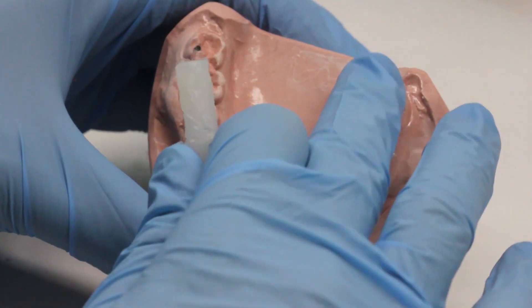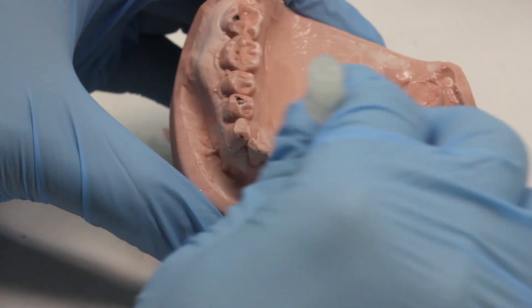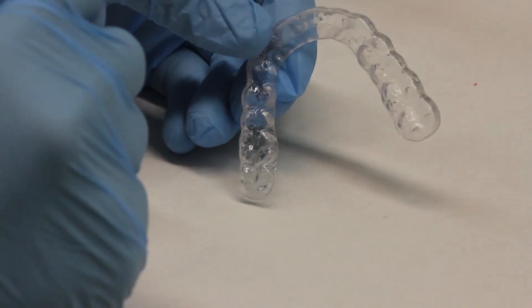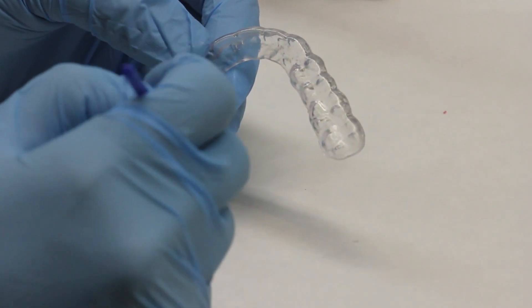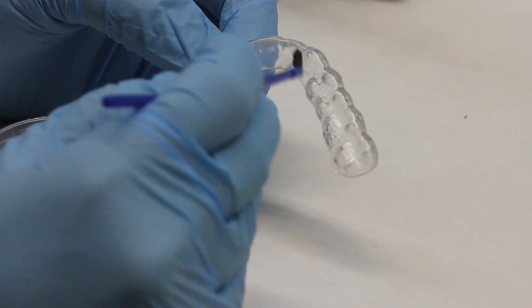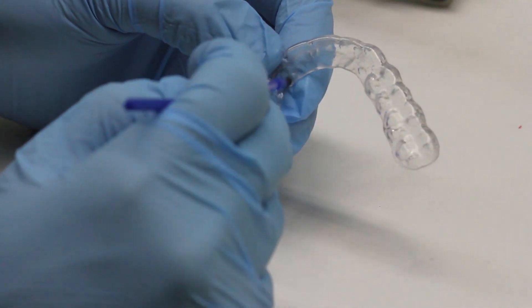At this point we want to paint the mandibular cast with Vaseline. This prevents any of the orthoacrylic that we're going to add to the splint from sticking to the lower cast. Now we're going to brush the splint material with a thin layer of monomer, which helps the acrylic adhere to your splint material.